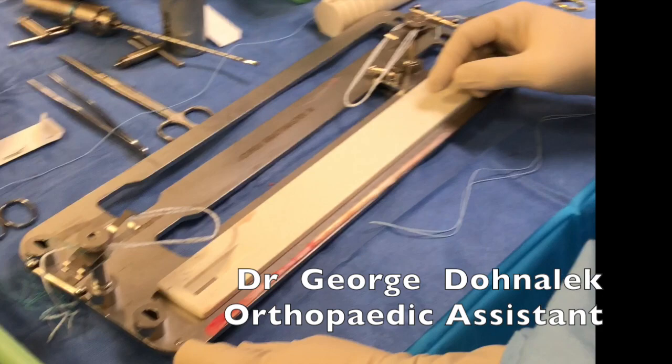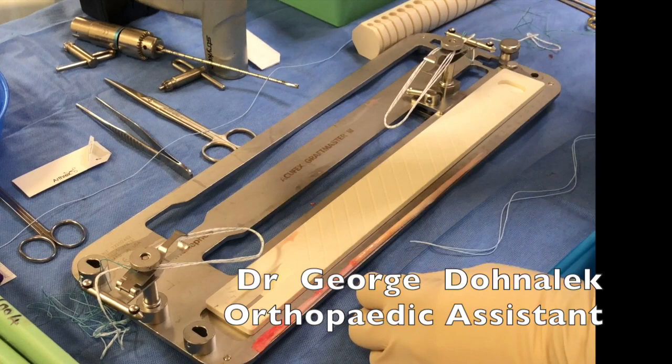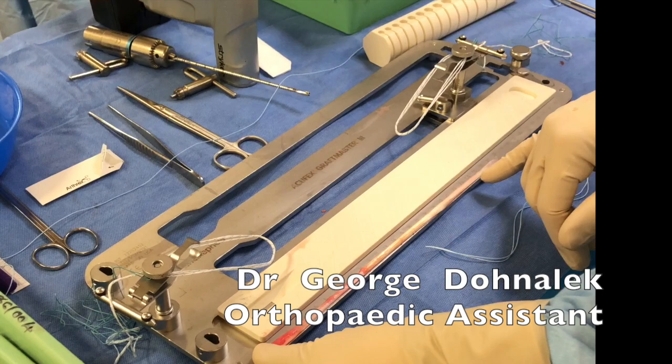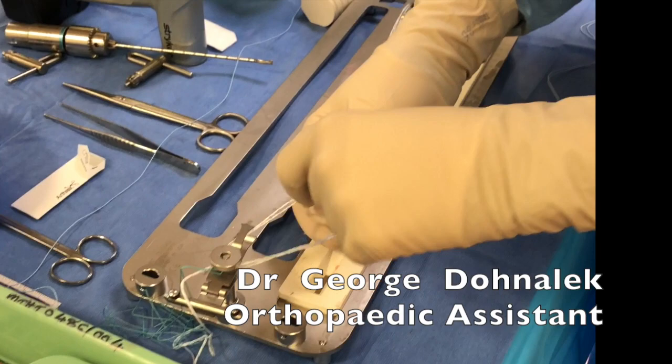The first step is to adjust your graft to the length of intra-articular graft that you're after. The formula is: the graft length will be four times plus one centimeter the length that you want. In this case we want a six to seven centimeter graft, so anywhere between 25 and 27 centimeters should be enough. The first step is to fold the graft in half.